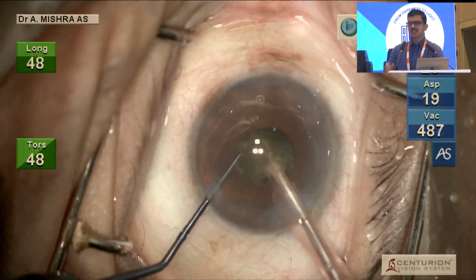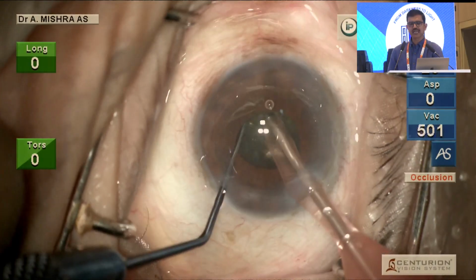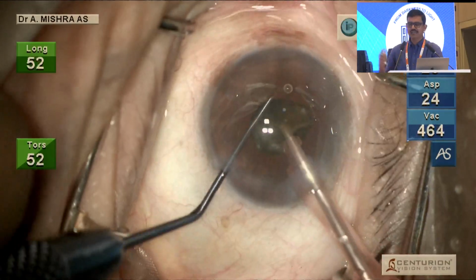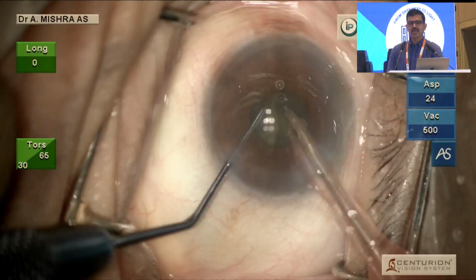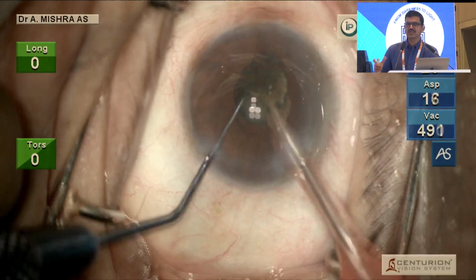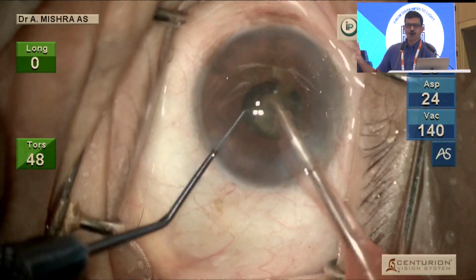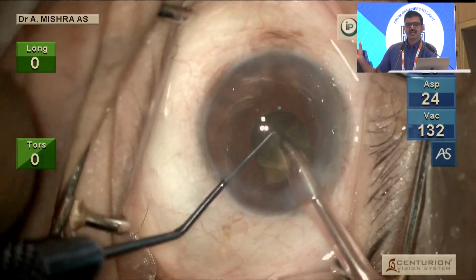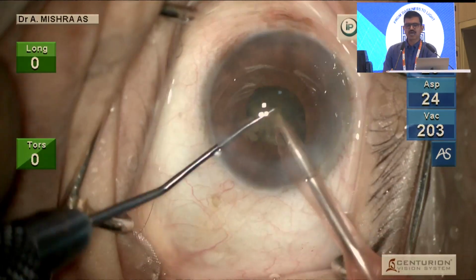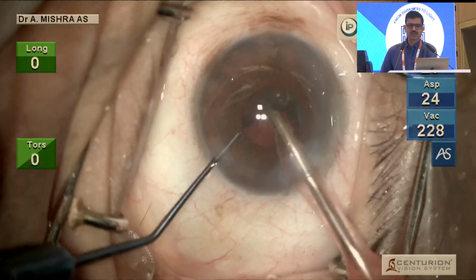Every time the apex of the nucleus is caught, every time you have to bring it to the middle to consume the remainder of it, because that's the safe area, as has been very nicely outlined by my previous speakers. This is an unedited video. This doesn't take too much time, and you don't need to change anything in the phaco parameters. Look at the IOP. I operate under IOP of 20. Even then, there is no danger of catching the pupillary margin because I am operating in the safe zone and I trust my machine to produce a stable fluidics.